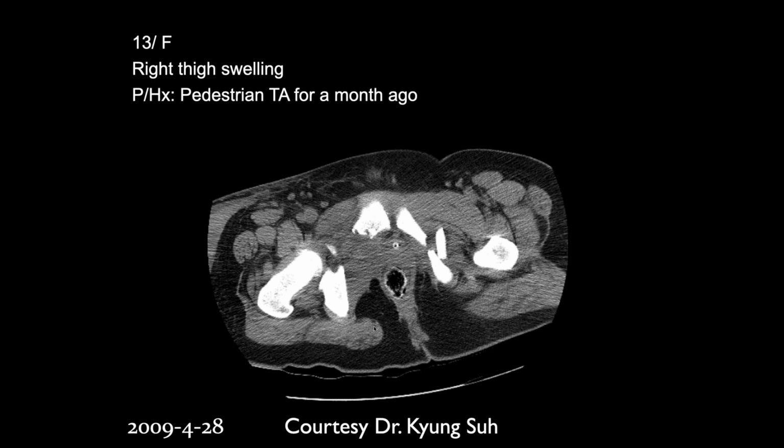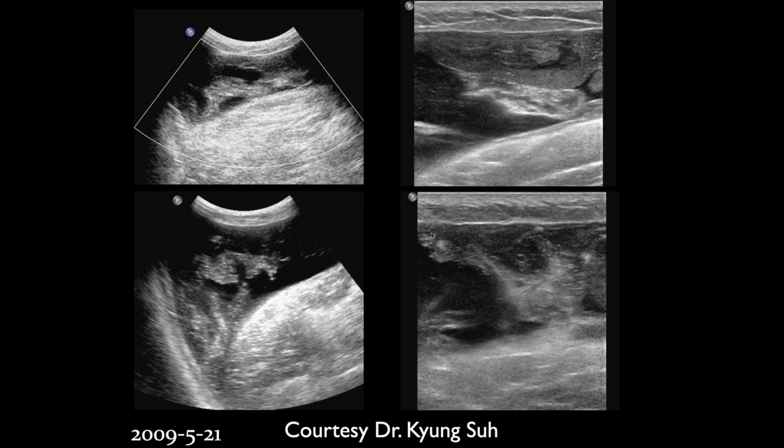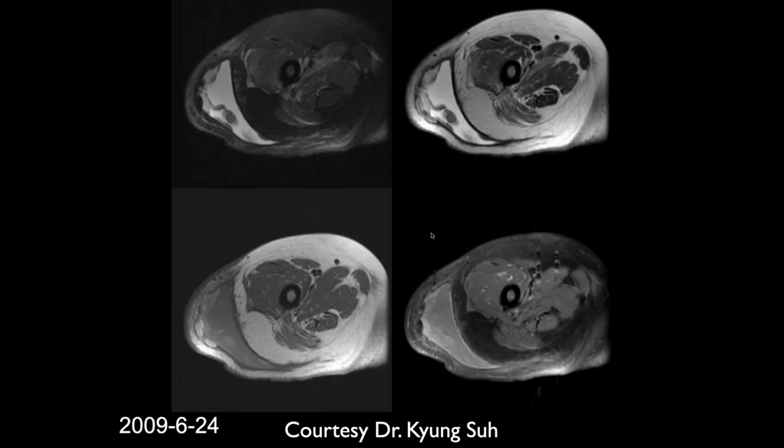Okay. Female right thigh swelling, pedestrian, was TA for a month ago. Traffic accident. So she's got comminuted fractures of her pubic rami bilaterally. So ultrasound, assume of the pelvis. So there's kind of heterogeneous fluid collection with internal debris, which I'm guessing is a large hematoma. I guess that's on the side of the thigh.